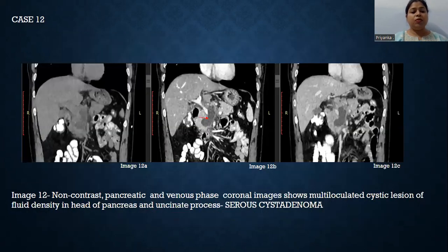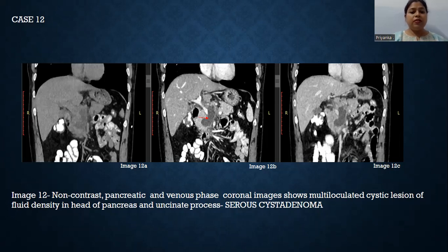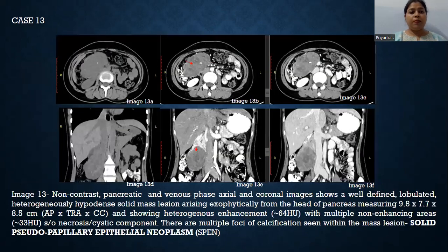Case number 12: Non-contrast, pancreatic, and venous phase coronal images show a multi-loculated cystic lesion of fluid density in the region of the head of the pancreas and uncinate process, suggestive of serous cystadenoma.